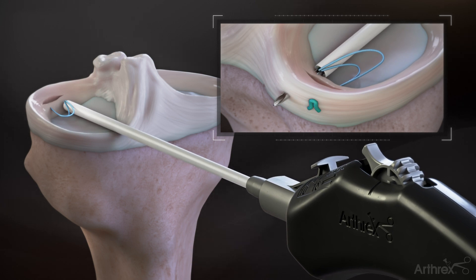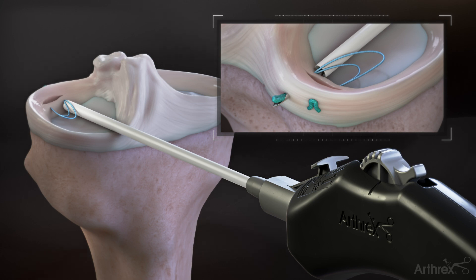Advance the needle tip through the tissue in the desired location and roll the deployment wheel backwards to the hard stop. Roll the wheel forward to complete delivery of the second implant.